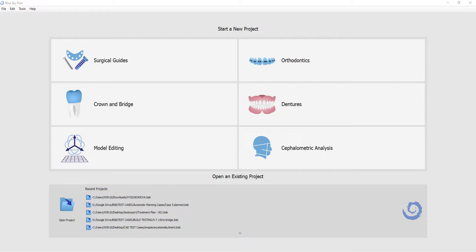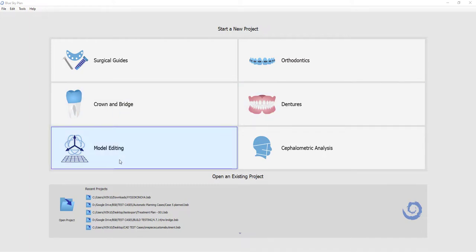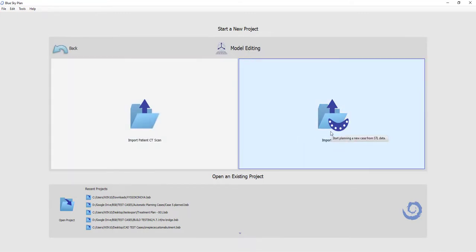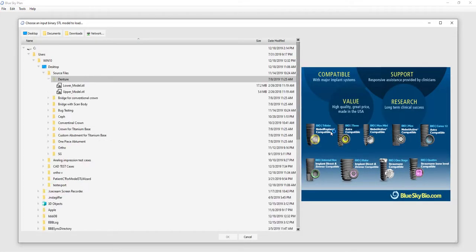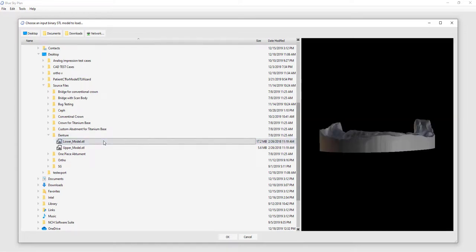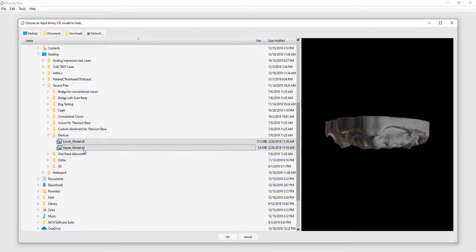Let's take a look at this functionality by clicking on Model Editing Module and then selecting Import Models. We're able to select one file or multi-select several files. This can be done by simply left-clicking on the first file, holding down the Shift key, and then left-clicking on the second, third, fourth, however many files is relevant, and then clicking OK.